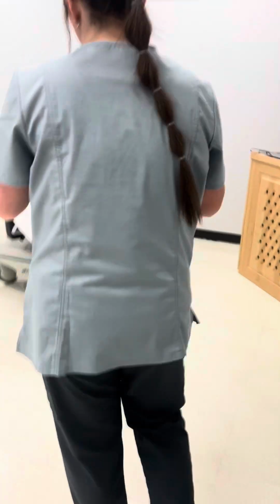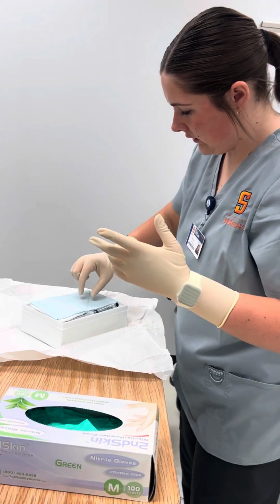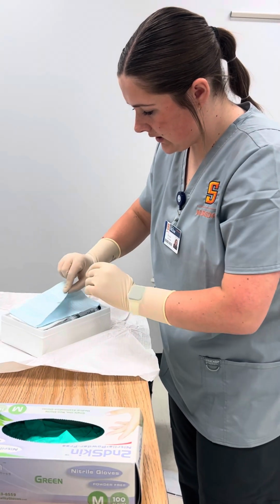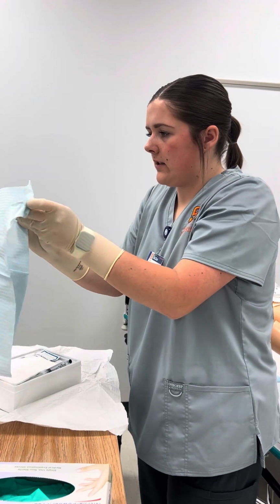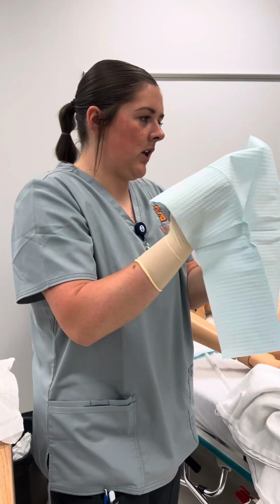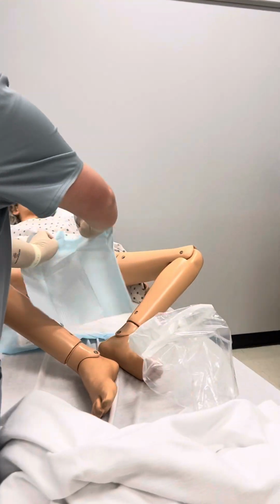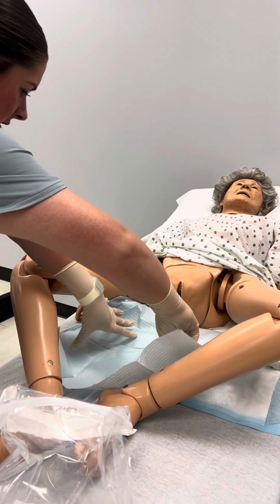Okay. Now I'm going to come over. I'm only going to touch one side of this. This is just a drape to go underneath my patient. Be careful not to touch anything. Keep my sterile field.